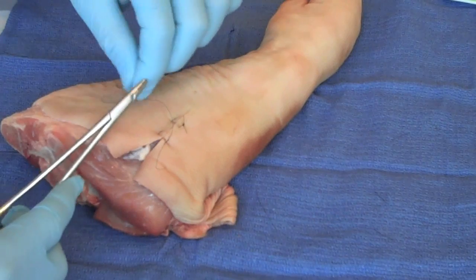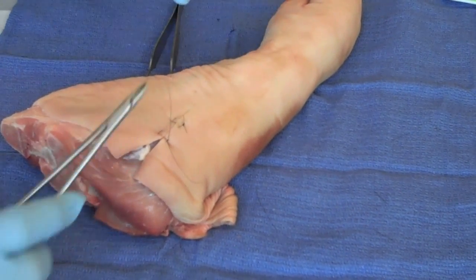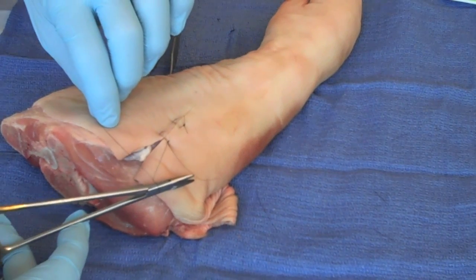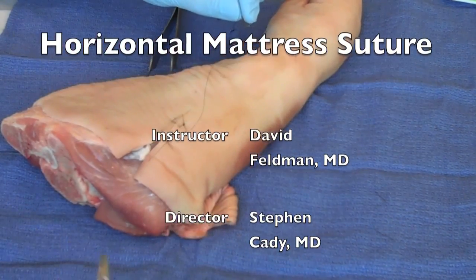And that brings the wound edges nicely together, and this is a much more stable closure. That's the horizontal mattress.